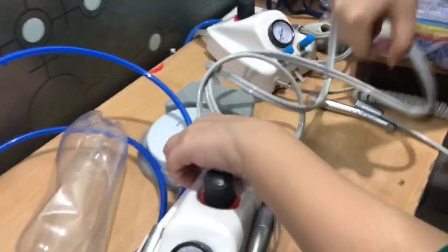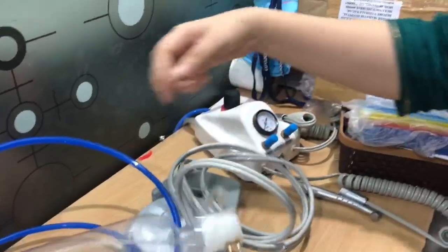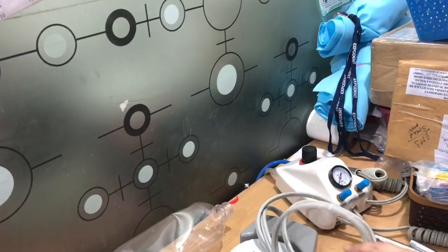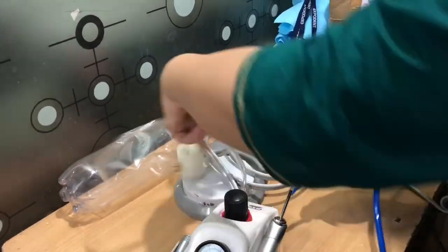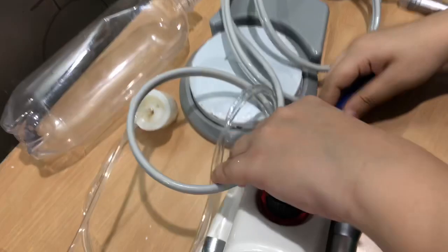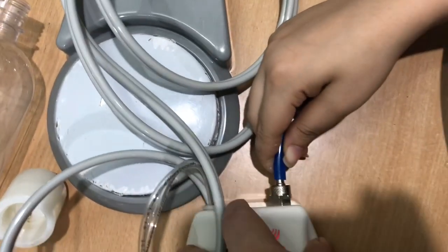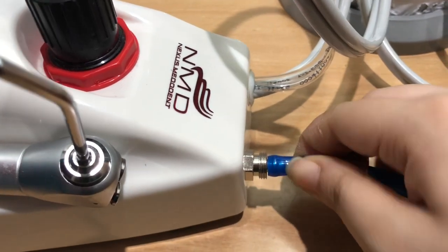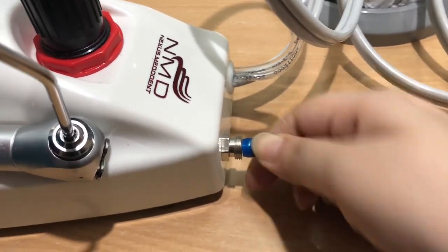This is the part which you need to place here like this. You have to remove this first and then you have to push this tube in the air inside this. And then you can see it already gone inside and then you need to rotate this like this.